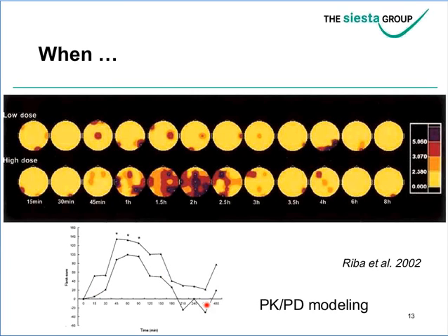So you would, in the end, get an interesting PK-like profile, but with the difference to typical pharmacokinetics that you're not measuring concentration in the blood here, but you're really measuring the activity of the drug in a temporal manner. This is why authors here typically talk about PK/PD modeling, another interesting feature of EEG measurements.